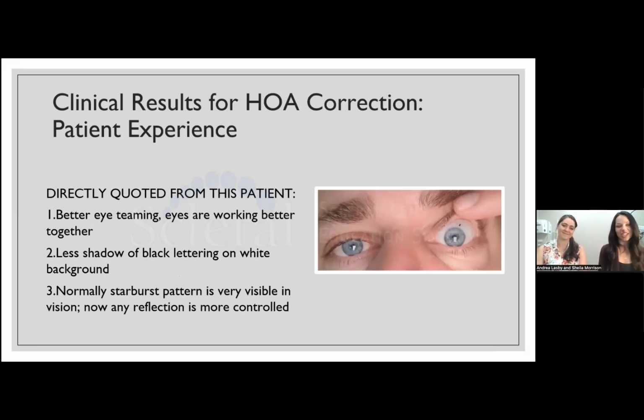And I wanted to share this because it's really cool. The process basically is fit the very best lens, work with a manufacturer that can create HOA lenses or can put the correction into the lens. Once a patient is fit properly with their best fit scleral with the best optic possible on the planet, with front surface toric, spherical haptic, changing eccentricity perhaps, then we take a measurement on top with an aberrometer, and that data is translated into a very specifically placed HOA corrective lens. And I have had some really incredible experiences, not many, because relative to our huge scleral population here, the ones that actually benefit from HOA correction are so small, but they are so important.